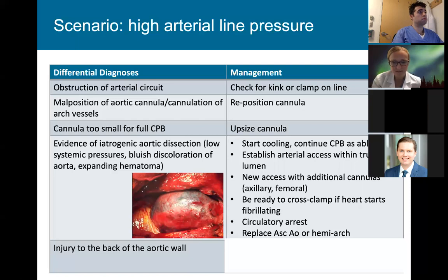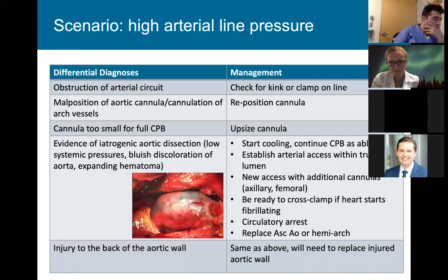I don't know if the attendings have any other tricks to add. I did not put on here call for help. If you're an attending as well, you'd want to have someone to help back up if this were to happen. The most important thing, Antonia, since you asked for attending's input, is remember not to move to the next step where you can't come back from.